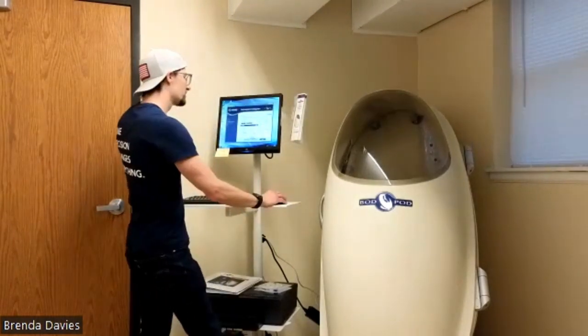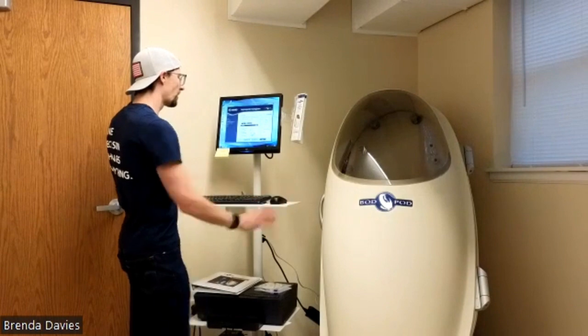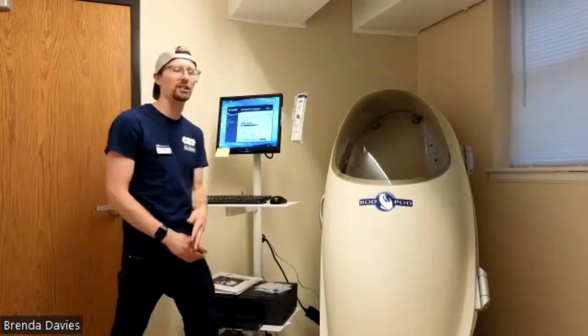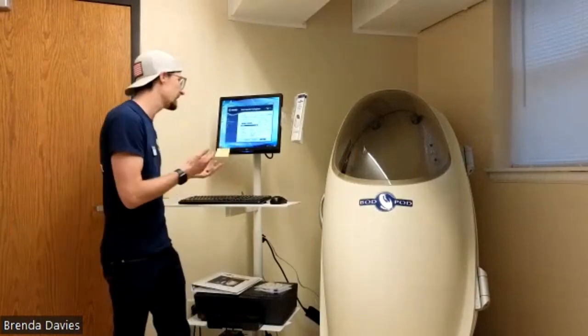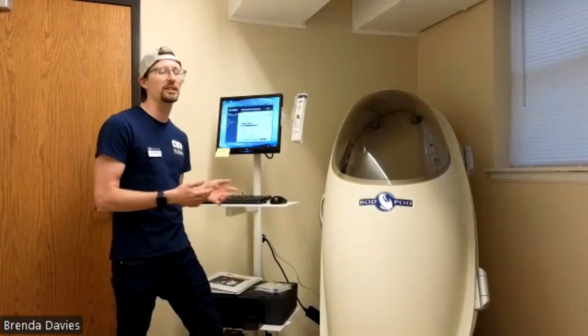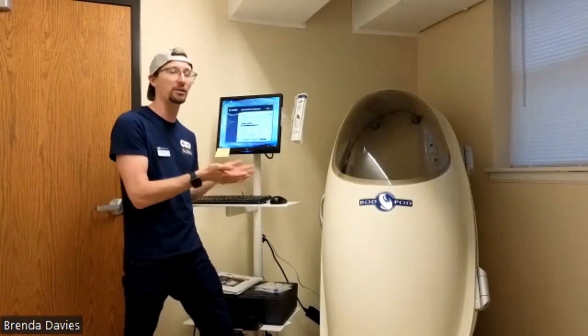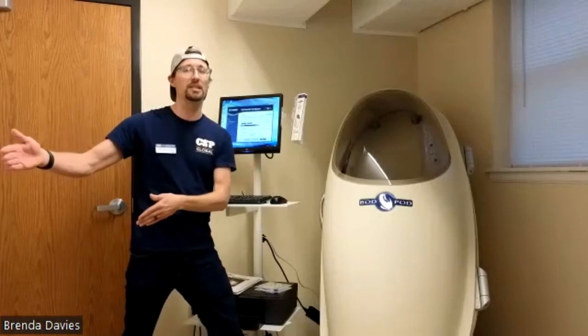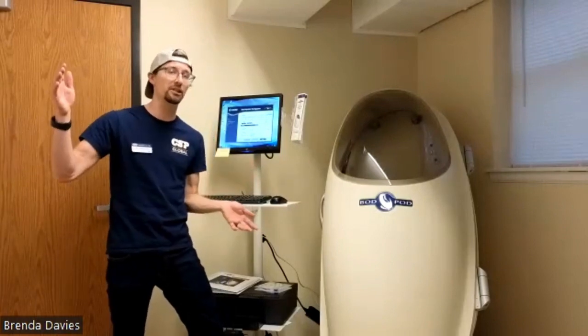Okay. So then you choose very active for the client, and then it will estimate what the total energy expenditure would be. In this case the estimate is 2857. Again, that's assuming that you're doing a moderate to vigorous intensity activity every day.